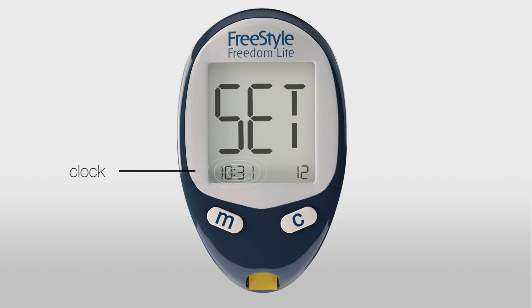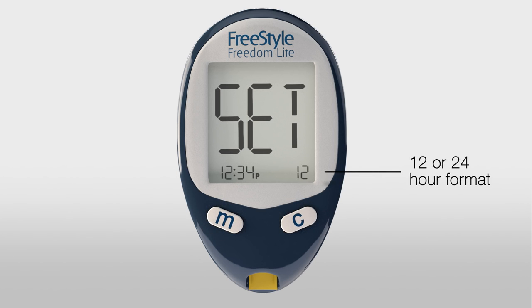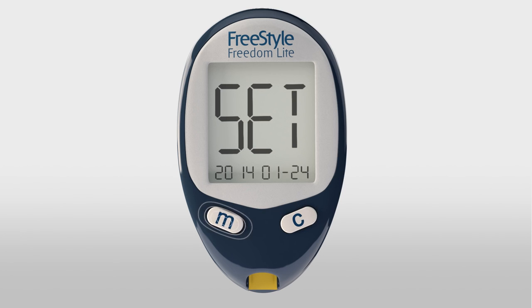Now let's set the time and date. First set the hour, then minutes, and finally choose either a 12 or 24 hour format. Next set the month, then the day. Change the year if necessary and save.